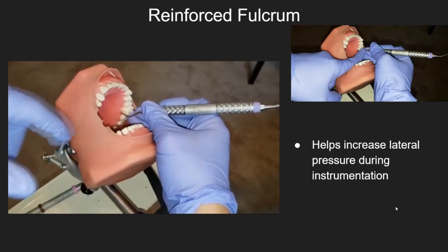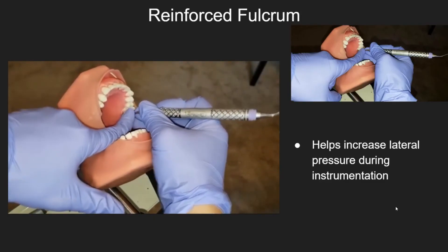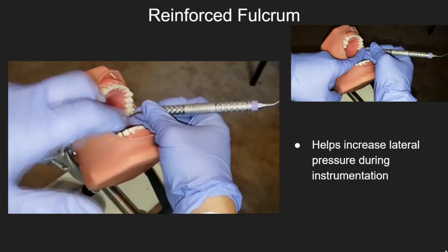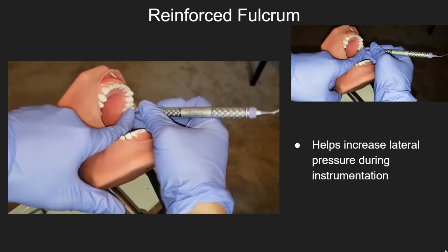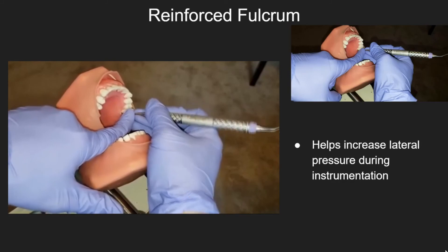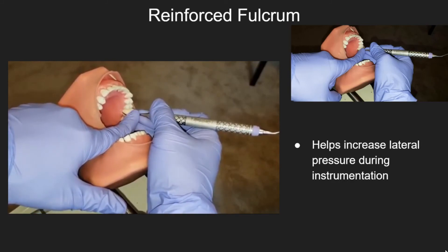Reinforced fulcrum. A reinforced fulcrum helps to increase lateral pressure during instrumentation. It is used by placing the fulcrum on the same arch that is being instrumented and placing the finger of the non-dominant hand on the lower shank of the instrument.